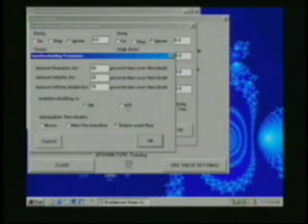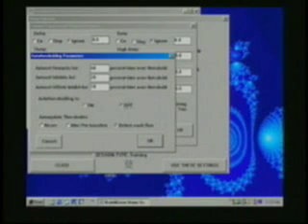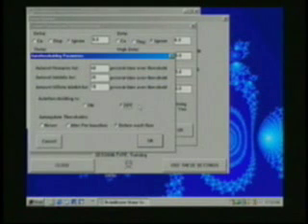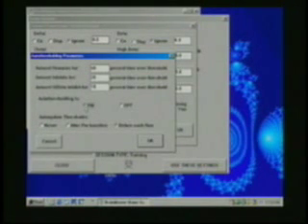In this selector we choose whether auto thresholding is on or off. If auto thresholding is turned off, then all threshold adjustments are done manually as in our previous software.